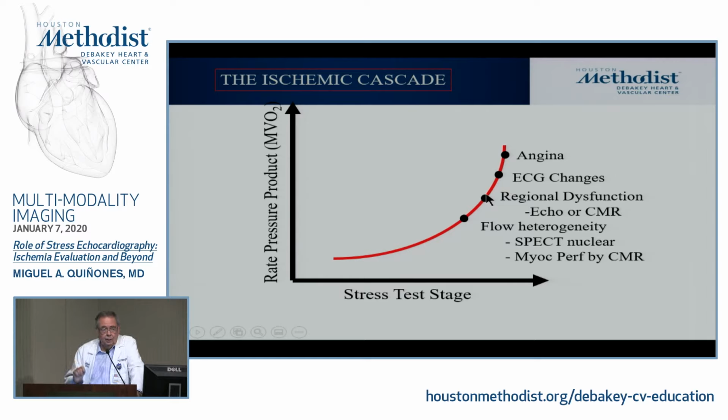In theory, though not always the case, all of these changes precede the ST changes on ECG, and they are all supposed to precede angina. However, that's not always the case. We see patients who sometimes have severe ST changes and we lack any findings on the echo, and then they get a cath and they have disease. So this is the general principle, but not every patient read the book and follows the rules.